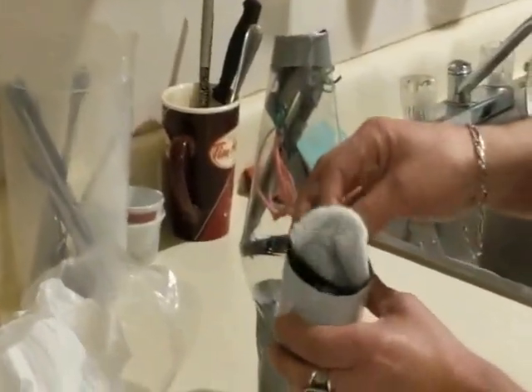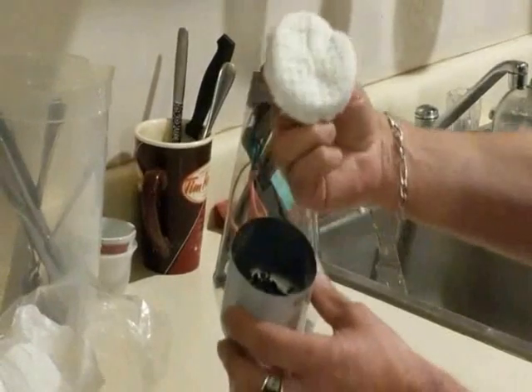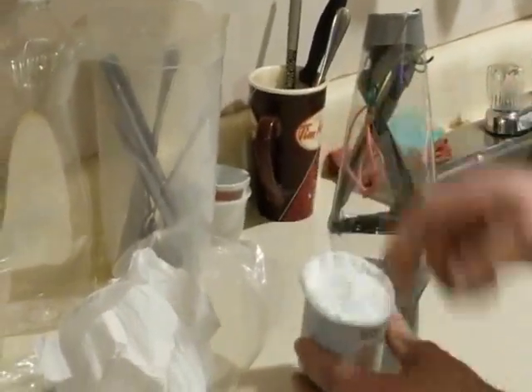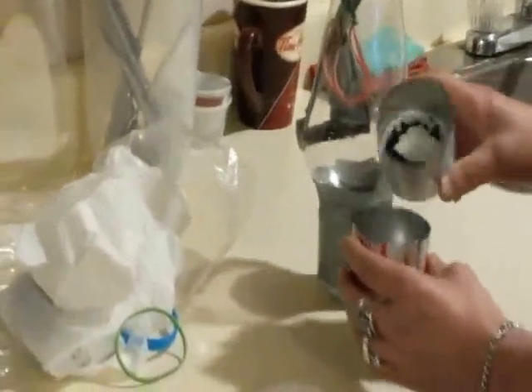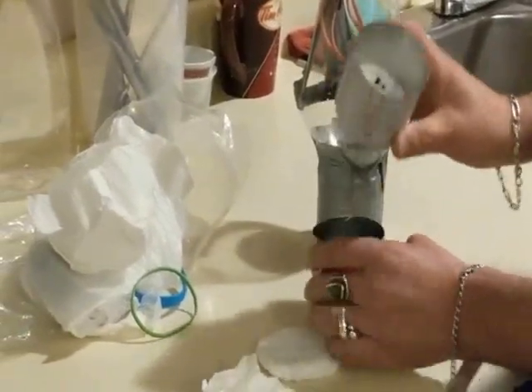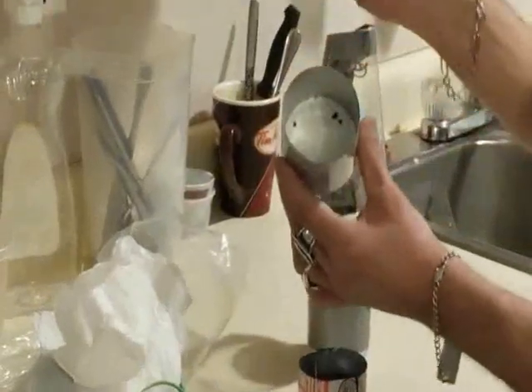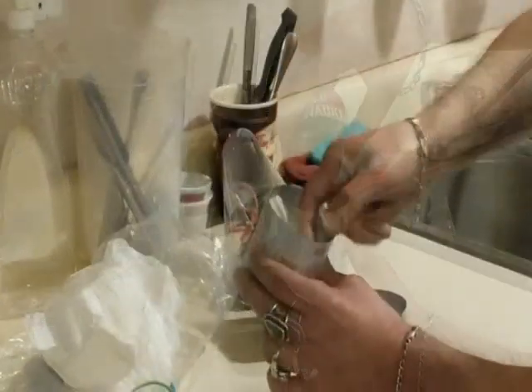The first layer was a piece of tissue paper. That is cotton. You can get that at the dollar store. And remember, get the larger ones. That way it fits a lot more snug into the beer can. That is the first layer, second layer, should I say. Next is the activated charcoal. You can find that at any fish store, Home Depot, or Walmart. At the bottom you'll see there's another cotton, just like the one that I'm holding in my hand. So there's 2 pieces of cotton, 1 tissue, and the activated charcoal.